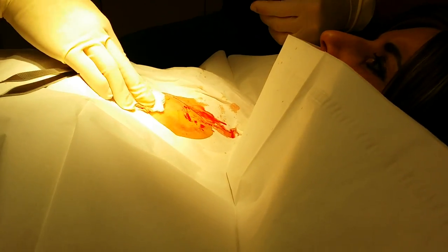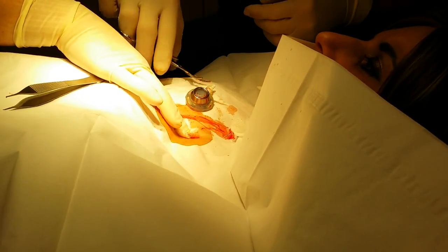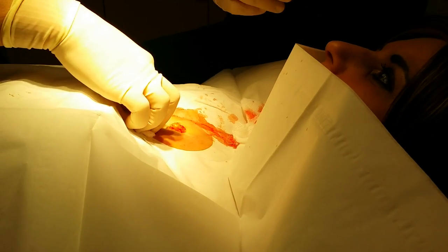All right, there it is! Oh my — it's all out. You can take that home with you if you want. I want to show my kids! We'll clean it off for you. All right, now we just have to close you back up, because you don't want to go home with that open.